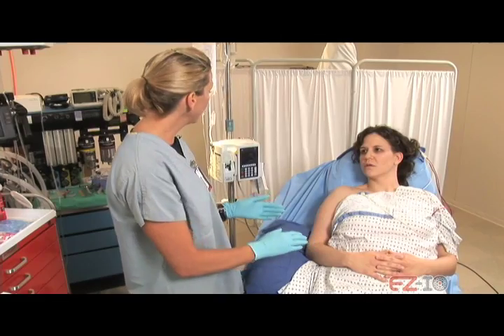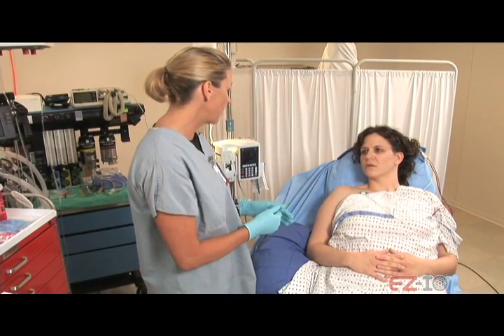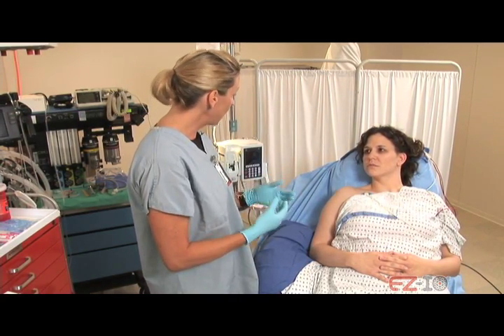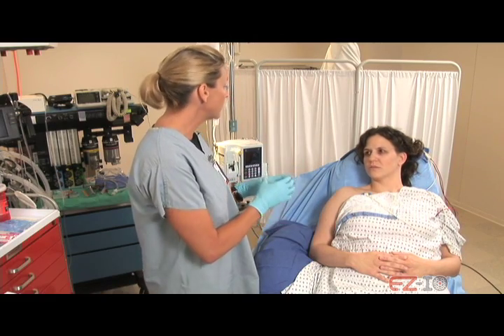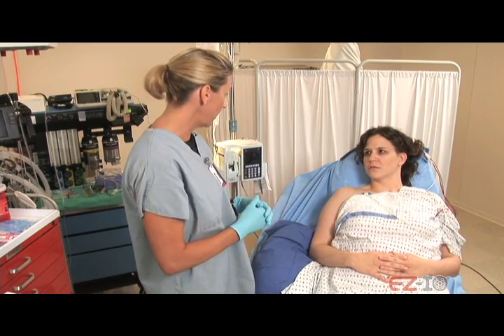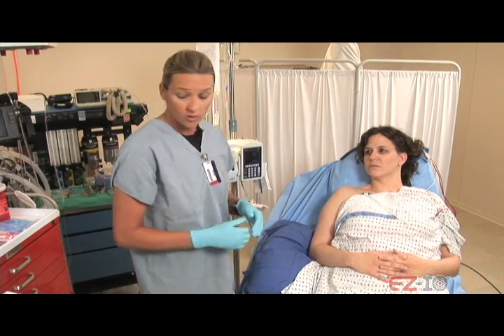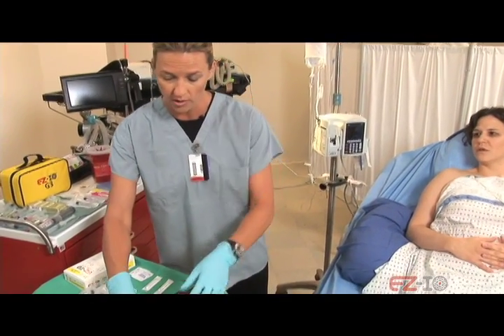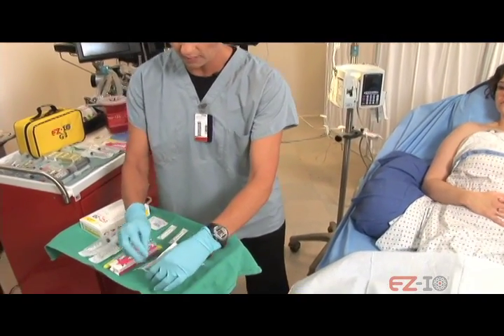Okay, so Karen, we were not able to get IV access, so what we're going to do is get vascular access by putting it into the bone. What you're going to feel is it feels a lot like an IV when it's going in. You're going to feel a little bit of pressure when it's going into the bone, and then I'm going to give you some medication once it's in there that's going to help numb that area up so you won't feel anything after that, okay? Okay. So are you allergic to any medications? Just penicillin. Have you ever had lidocaine before? Not that I'm aware of. Okay, all right.